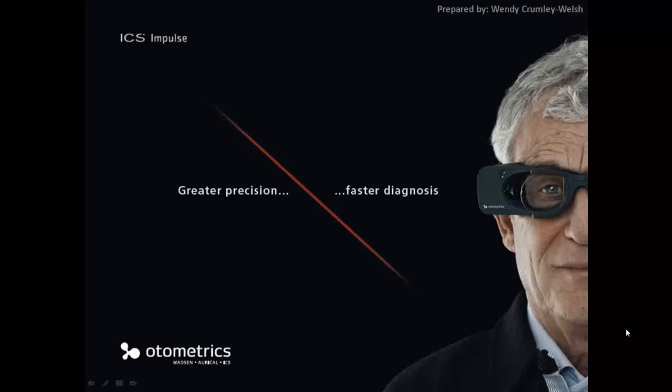I'm Wendy Crumley-Welsh, the product manager for ICS Impulse, and today we're going to be talking about reporting.